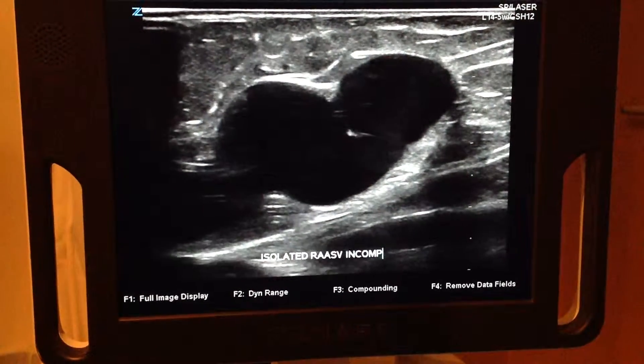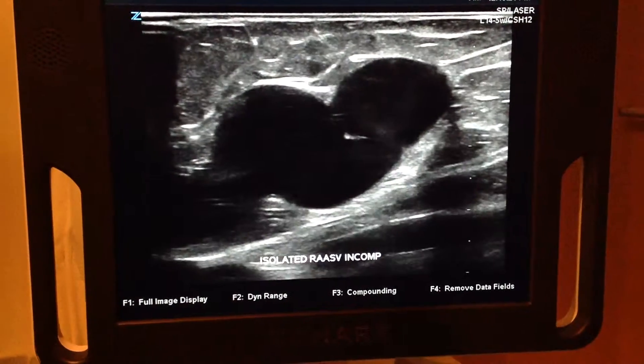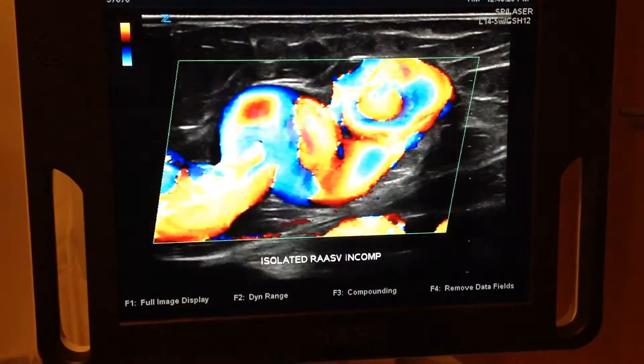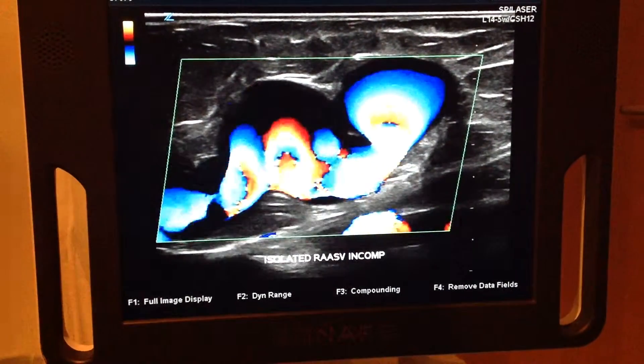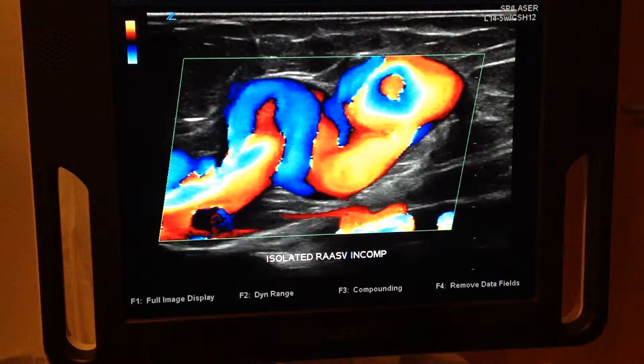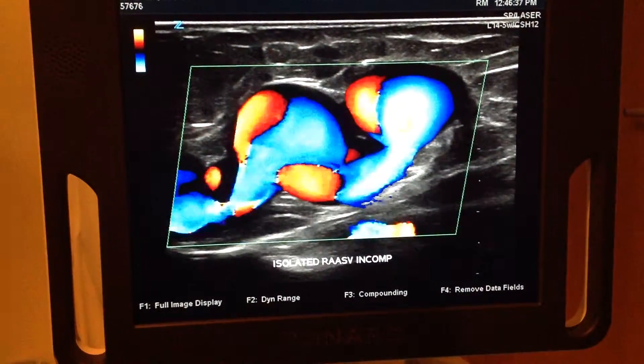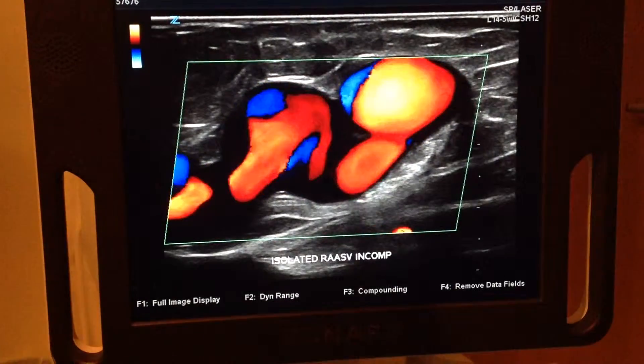If you could go into color, I would continue to record. And now we're going to show the same thing. As you can see, it's all reflux. Gold followed by red. Blue followed by gold, followed by red.